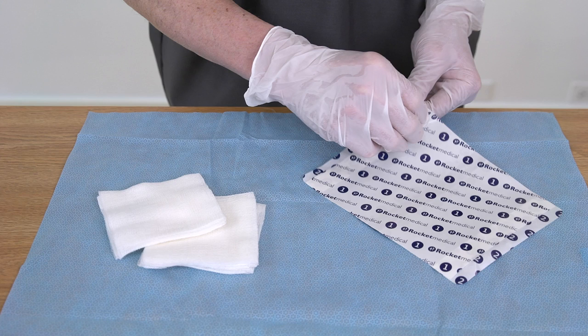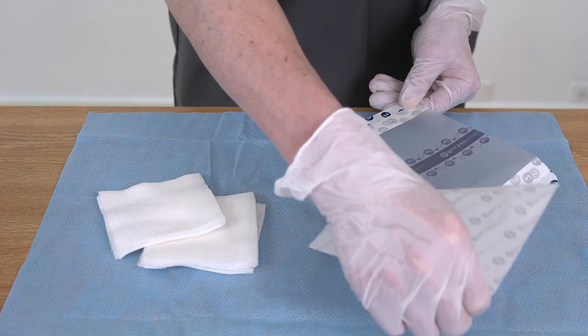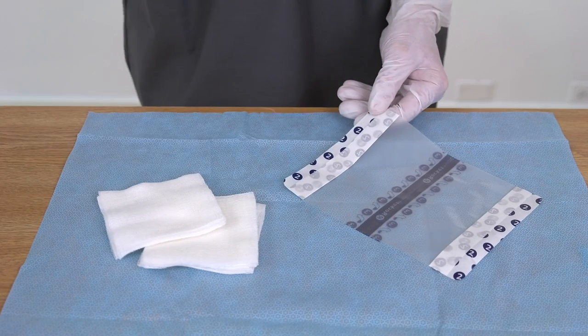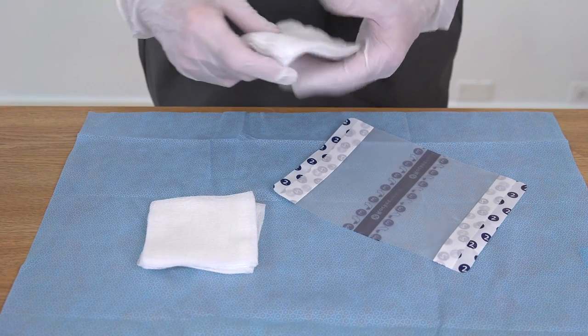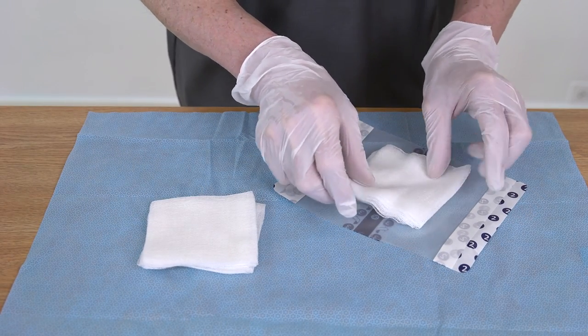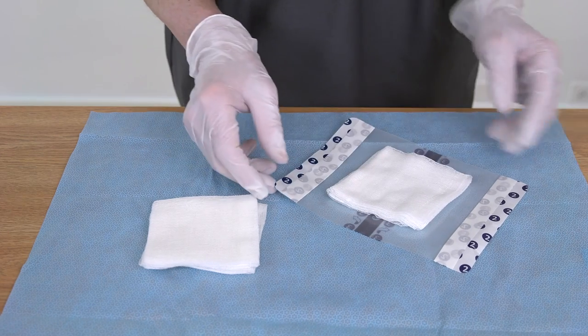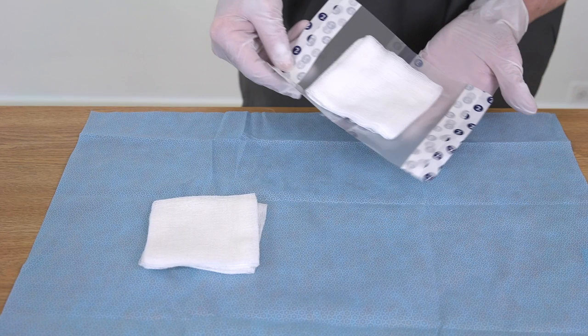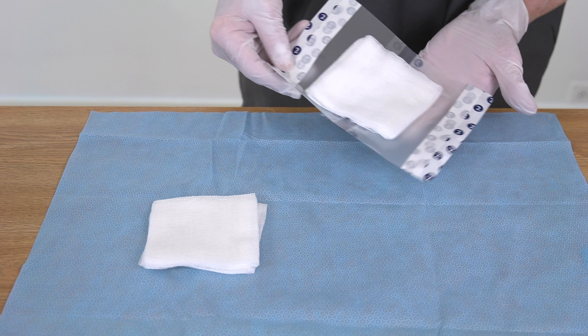Open the Seaview dressing with the backing material facing toward you. The dressing features a numbered, three-step application process. First, peel off the backing labeled 1, using the split in the center. Place approximately three pieces of gauze on top of each other in the center of the sticky material. Ensure there is plenty of space around the gauze. This will make it easier for you to apply the Seaview dressing.